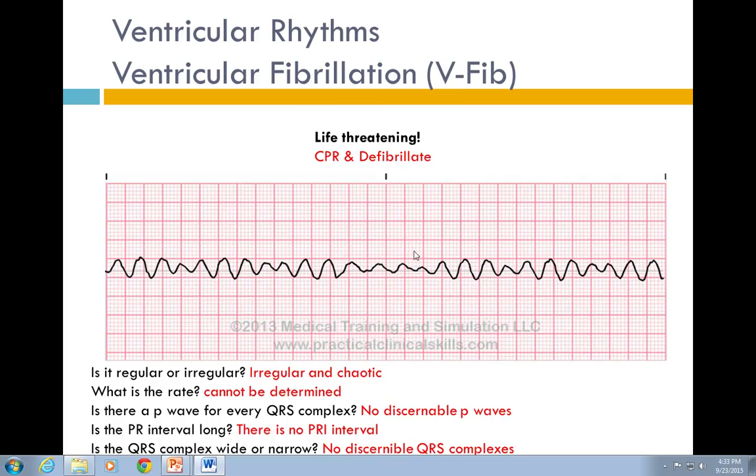If you see this, well, A, you need to memorize it. And if you see this, this is life-threatening. You need to begin CPR and defibrillate.